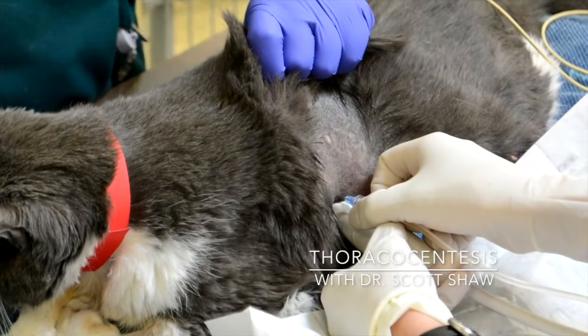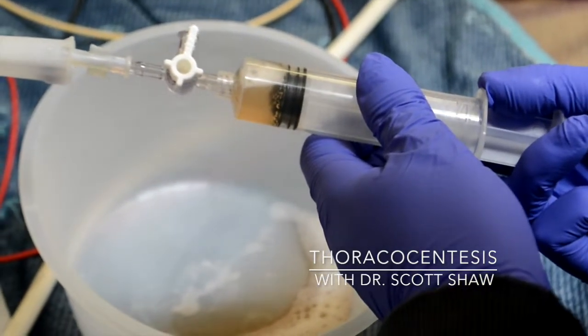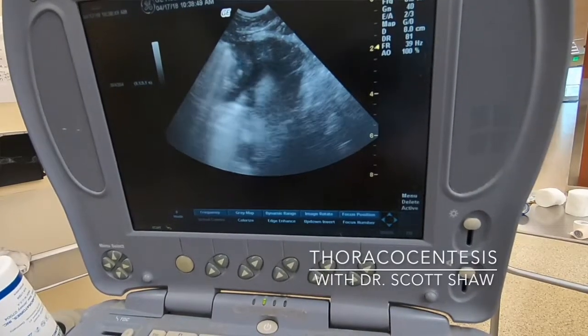People that don't perform thoracocentesis regularly tend to get freaked out by the thought of taking a needle, plunging it into a pet's chest, missing the heart, missing the lungs, and extracting fluid or air. But it's actually a really safe procedure. To be honest, I have seen more animals killed by a cystocentesis gone bad than a thoracocentesis gone bad.